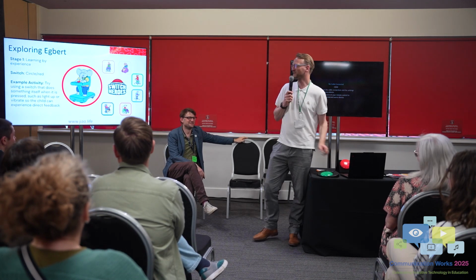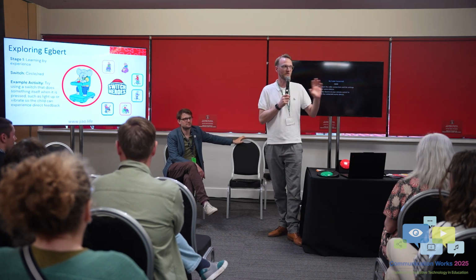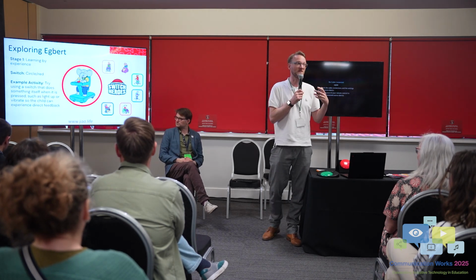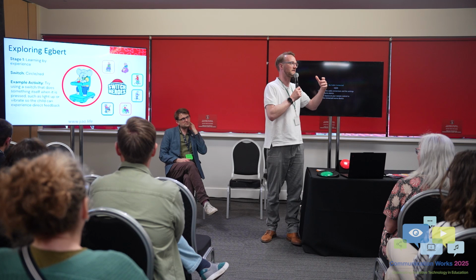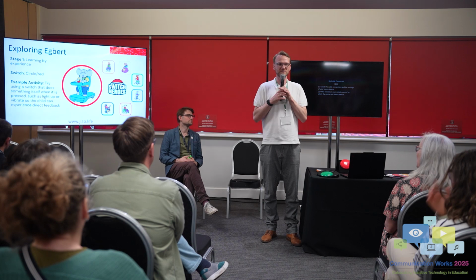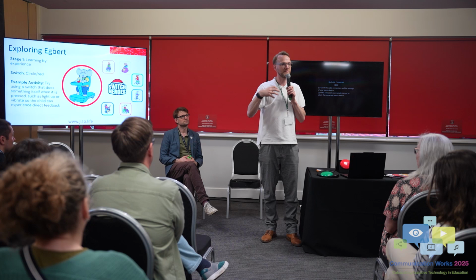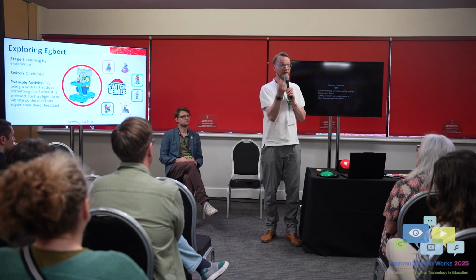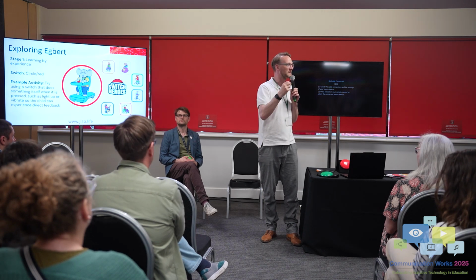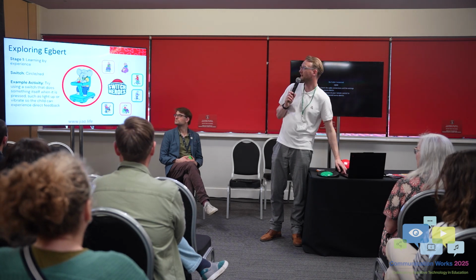Relax a little bit. So the first stage, Explore, like all the switch models out there, we start with cause and effect. So we're exploring, this is incidental activating of a switch to activate a sensory cause and effect activity. So don't start with a switch toy that's over in the distance that moves and maybe does lights. We're really thinking dark room, lights come on and it's really obvious when I press it, or vibration, or sound that's an immediate response.